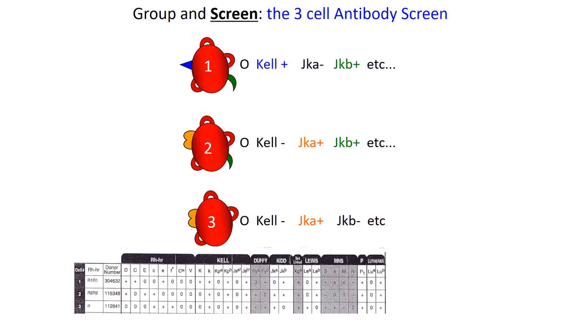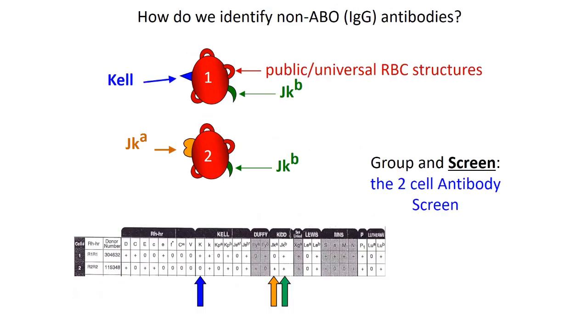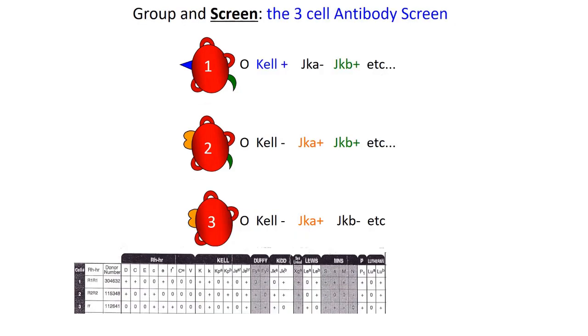In the 3-cell screen, you can deduce an anti-D if the first 2 cells are reacting, but the 3rd one isn't. You can't do that in a 2-cell screen, but the 2-cell screen, given its antigram, can give you a few other insights or at least a differential diagnosis. And likewise, you have a little more power to do that with the deduction powers coming from a 3-cell antigram.